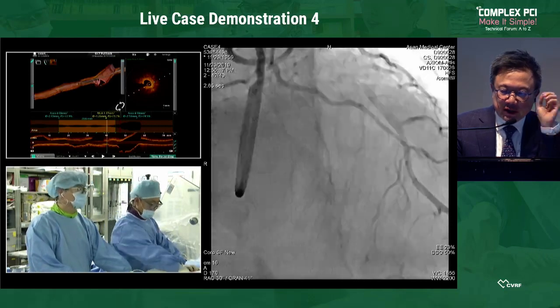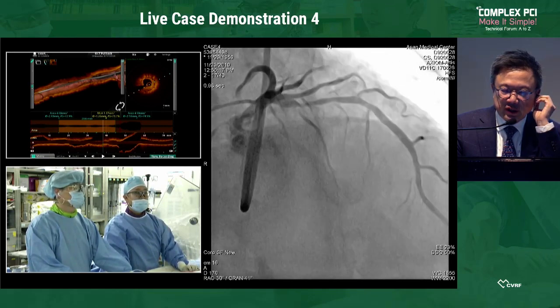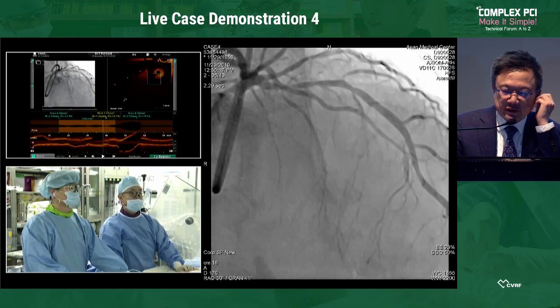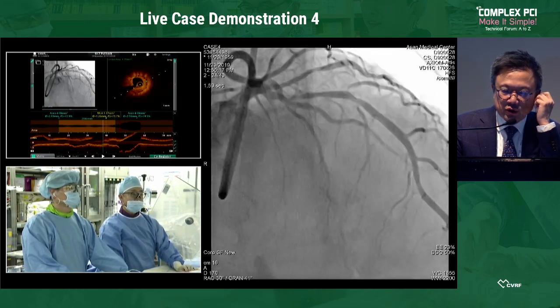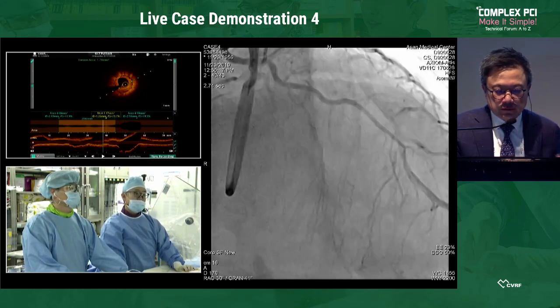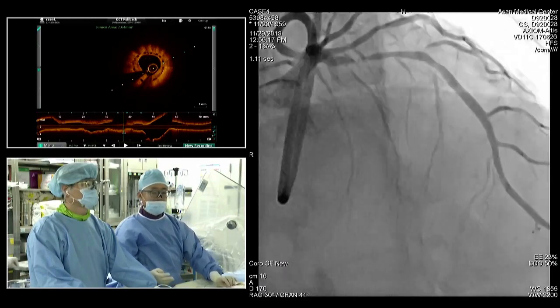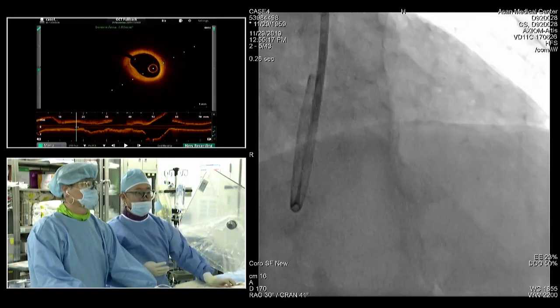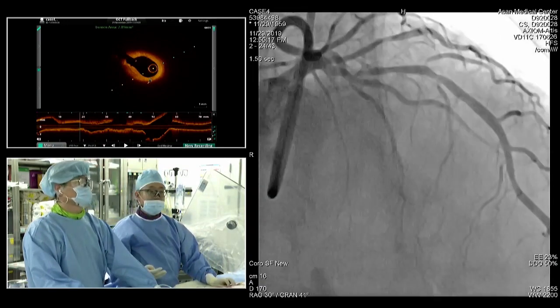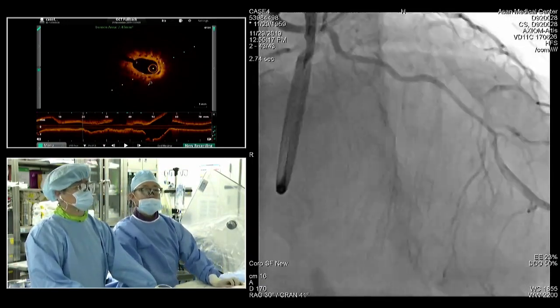I know that you show the one area where these stent struts are much smaller, but I presume all the black boxes left over from BRS are all relatively smaller compared to the original post-procedure results. Right. So any panel and any moderator, can you share the BRS failure experience and any imaging finding, or one of the interesting imaging findings, something like that?